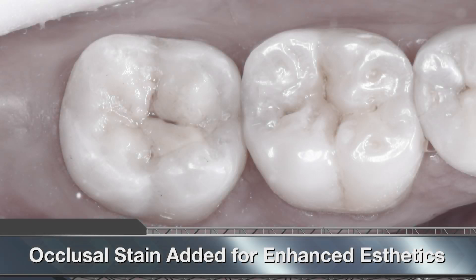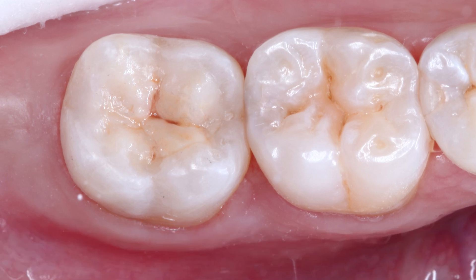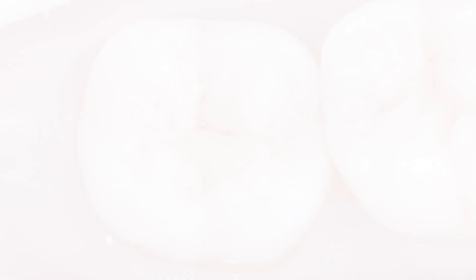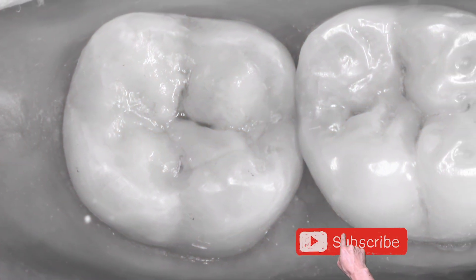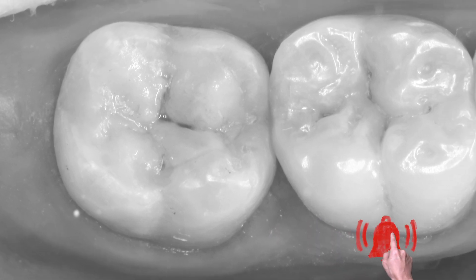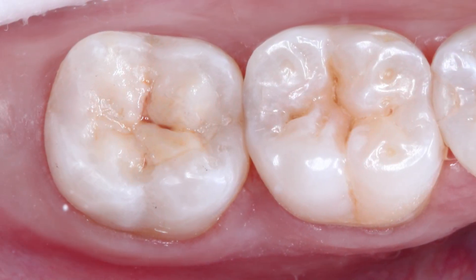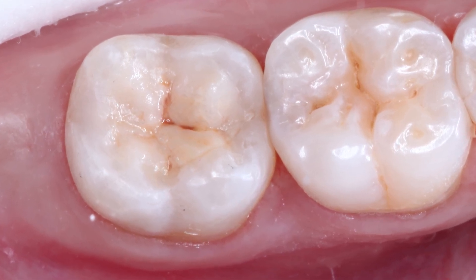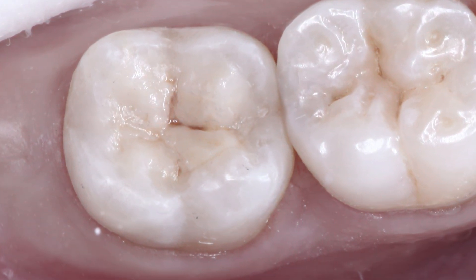We were able to successfully restore the patient with a direct resin restoration that's both strong and provides great natural aesthetics. Two days after the procedure, the patient reached out and told me all of the pain and sensitivity has stopped. As a clinician, it's gratifying to be able to take our patients out of pain and address their issues in the least invasive way possible.